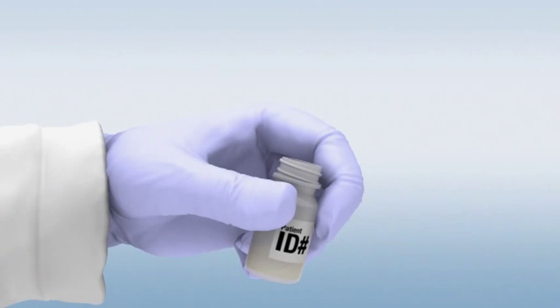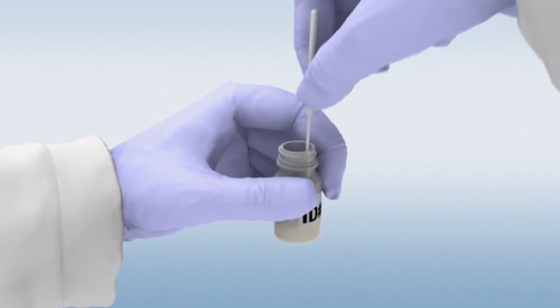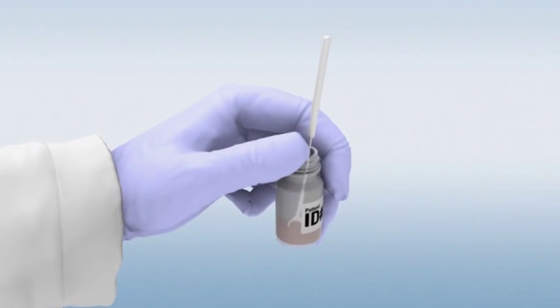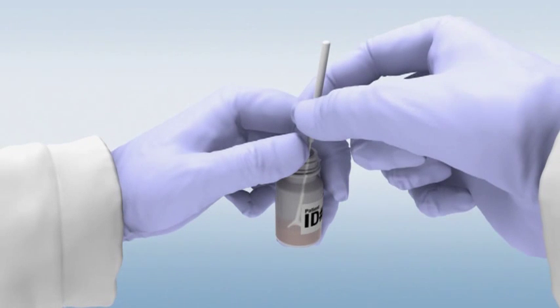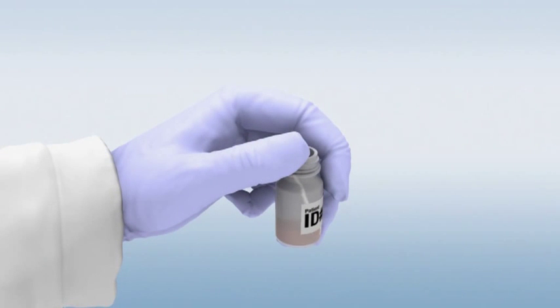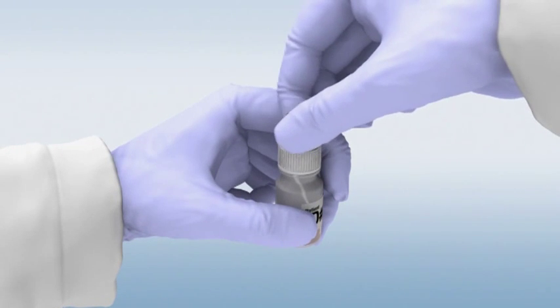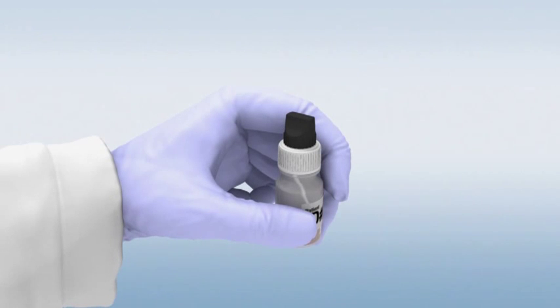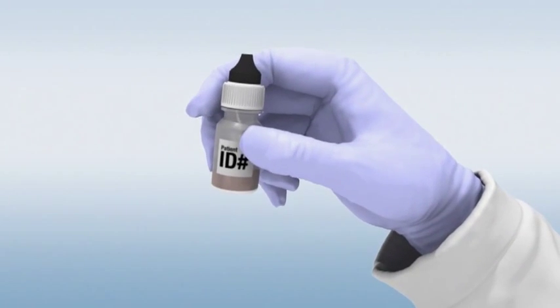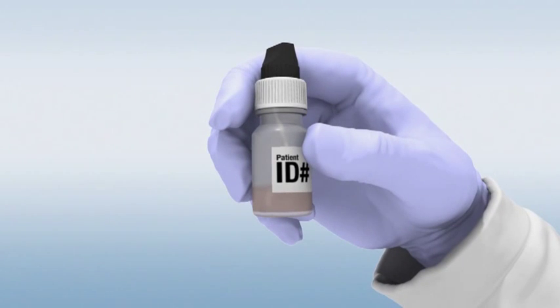Place the collected sample into the labeled black cap sample tainer. Ensure that the loop with the sample rests on the bottom of the bottle. Gently break the loop by applying pressure to the shaft at the break notch. Discard the loop shaft into a waste container. Place the white cap with the upper black cap back onto the sample tainer containing the loop tip. After securing the cap tightly, gently shake the bottle back and forth for 10 seconds. Remember to mark the bottle with a sample ID.